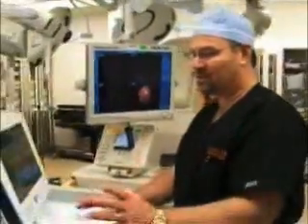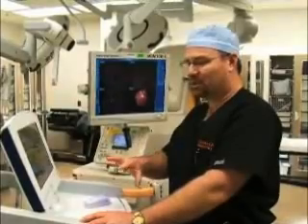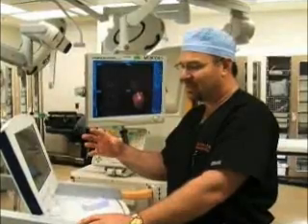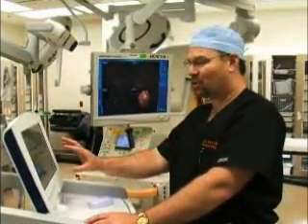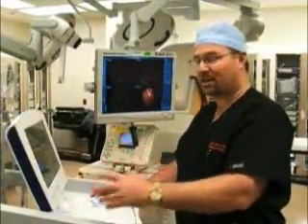This also helps us limit the size of the craniotomy and helps with orientation. When you have a tumor at the base of the skull or in the brain itself, the anatomy around it is distorted. This has helped us tremendously in more modern, contemporary brain surgery — it helps you stay oriented. Due to shifts of normal tissue or distortion of it, you can get an idea of where you are using the computerized guidance system. Usually we know where we are, we think we know where we are, but we can confirm it with this, and it is very precise in showing us where we are in the brain or around the outside of it.